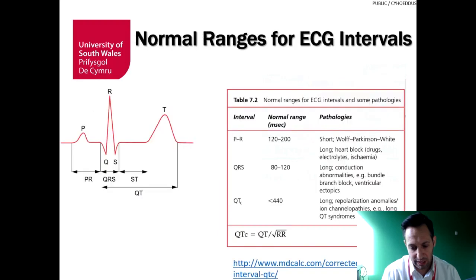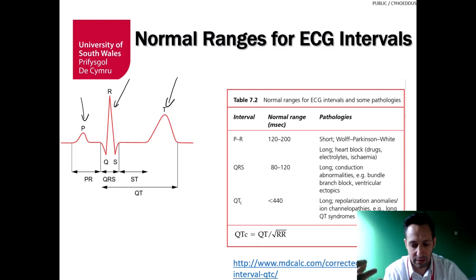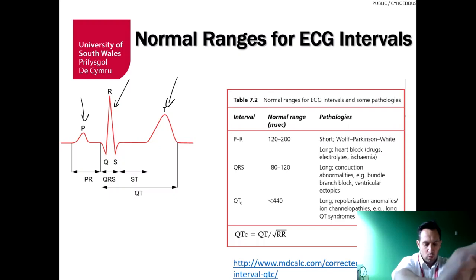What I would like to do now is to draw your attention to this slide, where we are taking the ECG complexes that we talked about earlier, and we're going to start to think about them like medics. So we know how long a cardiac cycle should be. We did it in Slice 2. We know what that all refers to and where the waves are coming from.